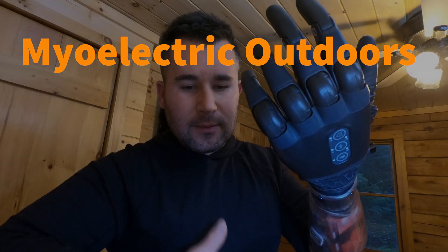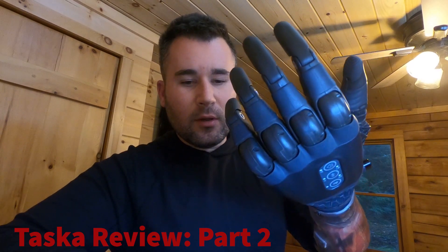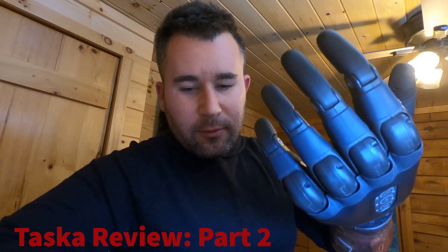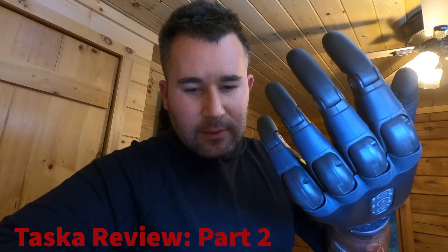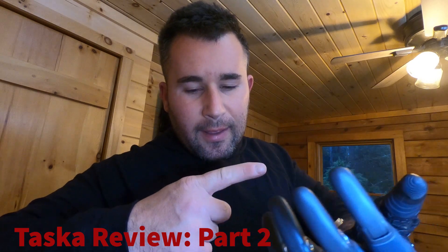This is part two of the Tasca review. Tonight we're going to go through a little more detail — we're going to talk about the different grip patterns, show you how you can control this hand with a cell phone, some other cool features, and a couple of things I don't like that Tasca should have done better. Let's get started.